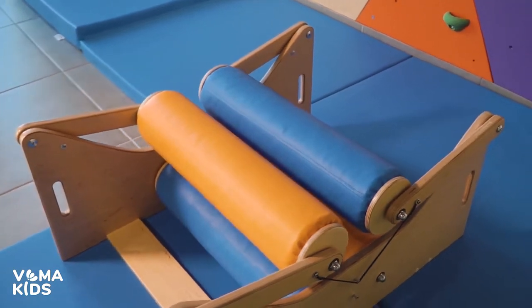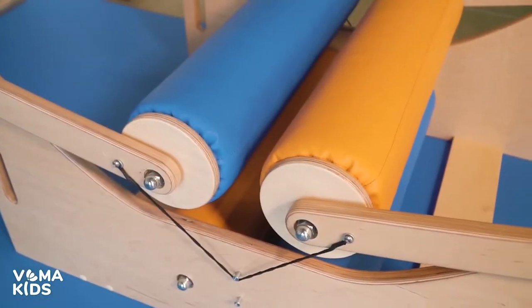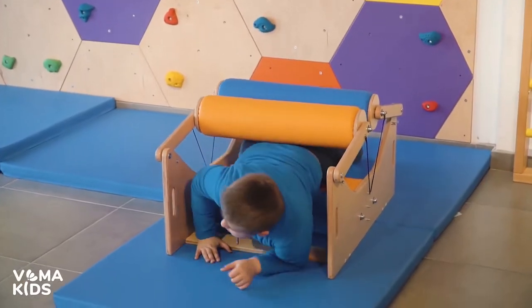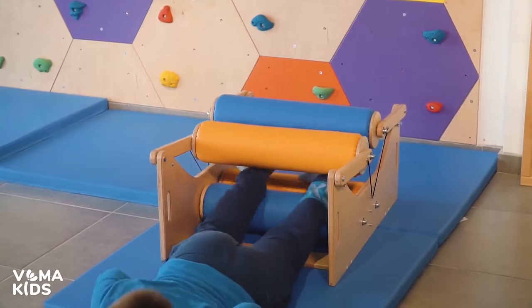The squeeze compression machine is a unique piece of equipment that allows you to develop not only physical, but also physiological capabilities of the child. It is used by specialists during sensory integration therapy.